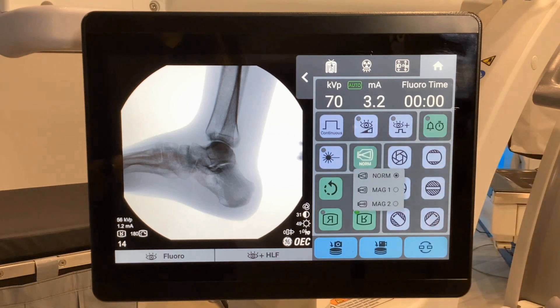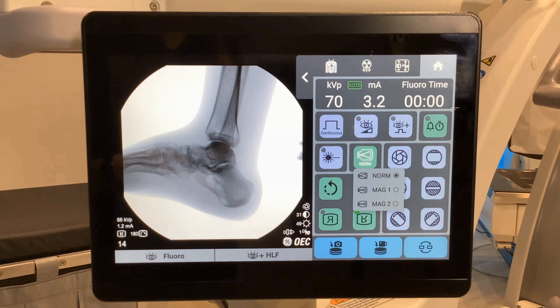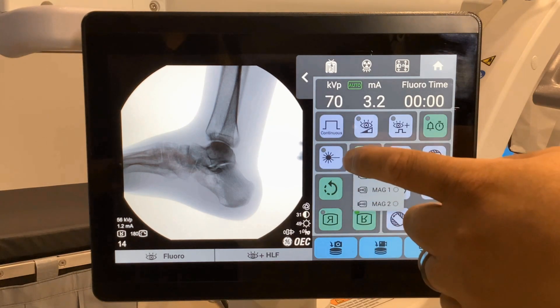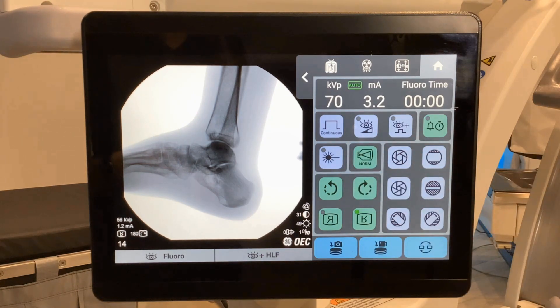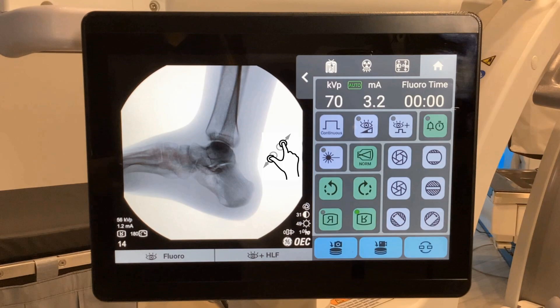Magnification. This particular system is a 31 cm. Mag 1 will take you to a 21 cm field of view. Mag 2 will take you to a 15 cm field of view. Select the option you prefer for imaging. An alternative to magnification is live zoom. The live zoom feature allows you to digitally magnify anatomy during a live shot, cine run, subtraction, or roadmap. Images can be zoomed up to four times.